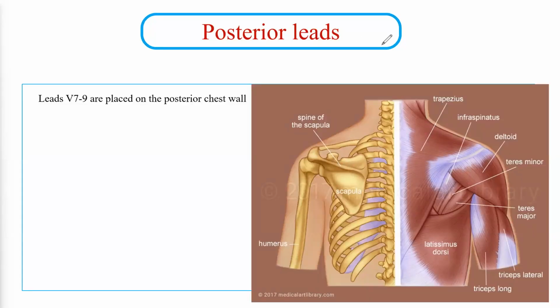In this video, we will talk about posterior lead placement. Usually we use the posterior leads for detecting posterior ST segment elevation MI.